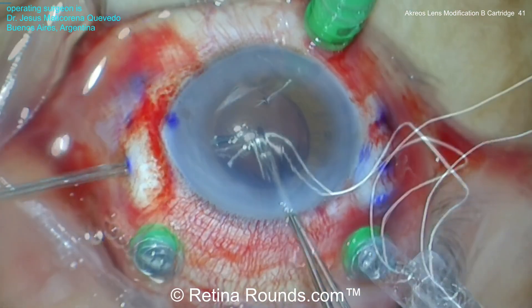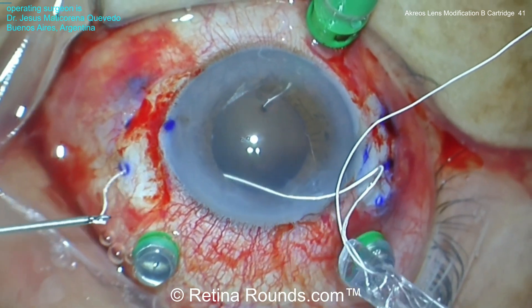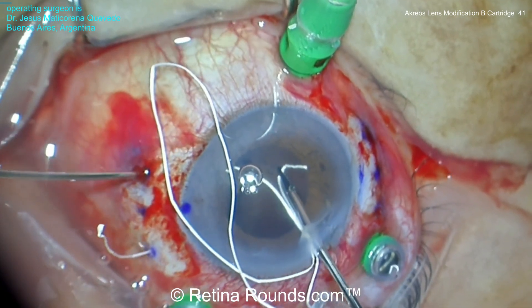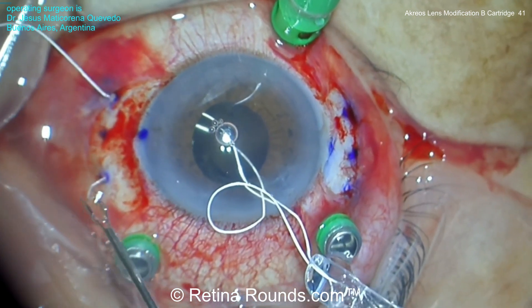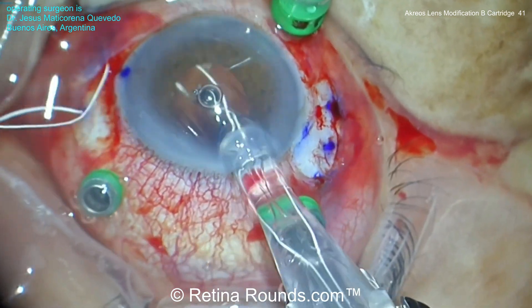Using a handshake maneuver, the Gore-Tex suture is externalized through the corresponding sclerotomy. Again, it's important to keep these sutures straight so that you're externalizing through the correct sclerotomy and not crossing the sutures. Once those Gore-Tex sutures have been pulled through, you can then visually confirm that the sutures are straight and not crossed.